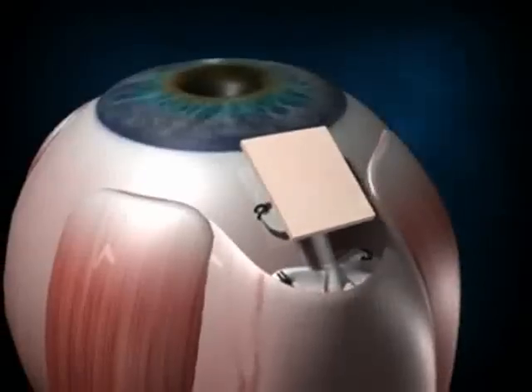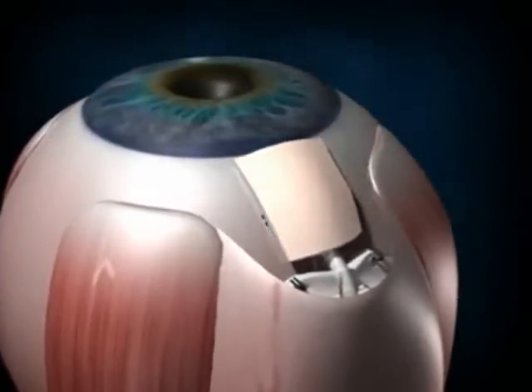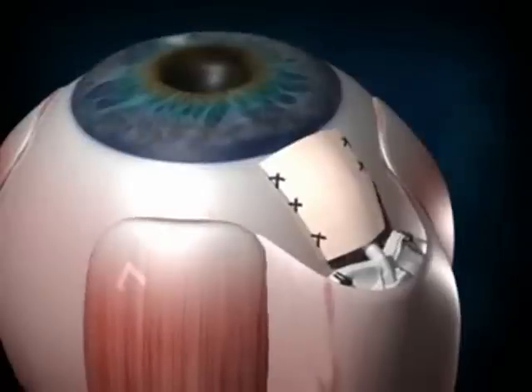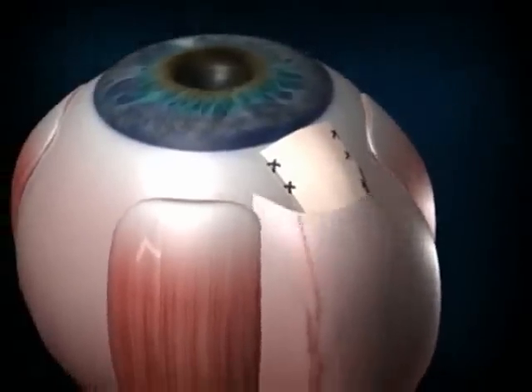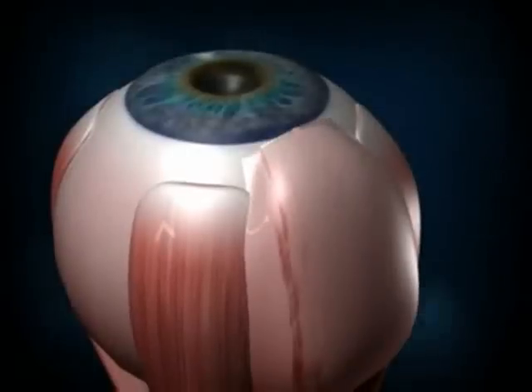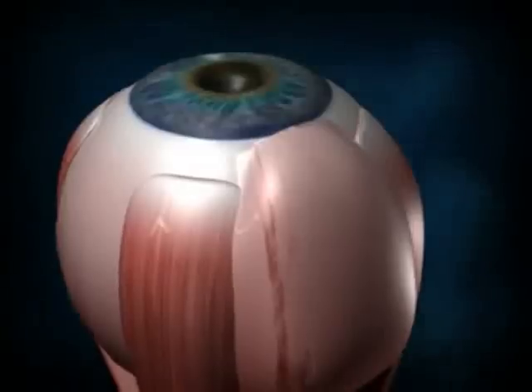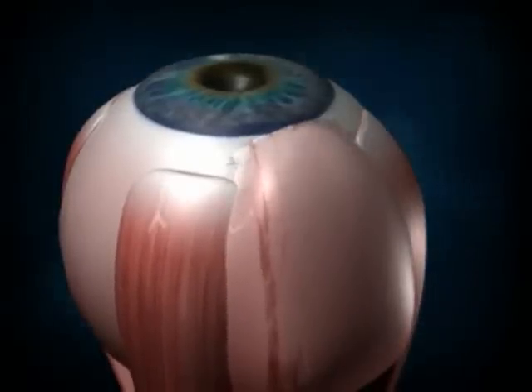Covering the tube with donor tissue. Place a patch graft over the pars plana clip up to the end of the limbus. Suture the graft with 8/0, 9/0, or 10/0 nylon or Vicryl absorbable sutures. Pull the conjunctiva over the clip and close the wound by suturing it.